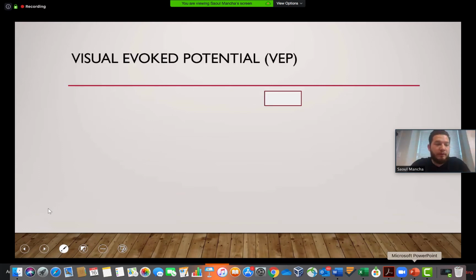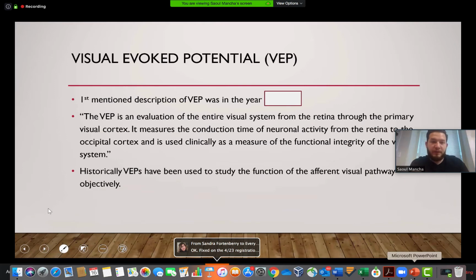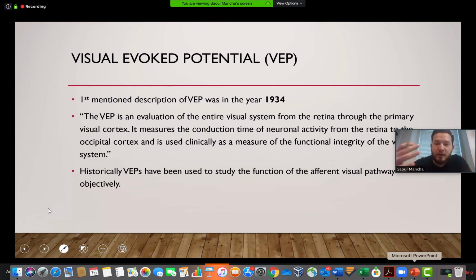So just a couple of trivia questions. Anybody can type them in. If Dr. Trevino, you can shout out the answer. Does anybody know what year the first mentioned VEP was? It's a little bit harder to do this on a live webinar than inside of an actual lecture hall. But the first mention was 1934. I always do this to highlight the fact that this is not new technology. This has been around for quite a while, about 86 years or so.